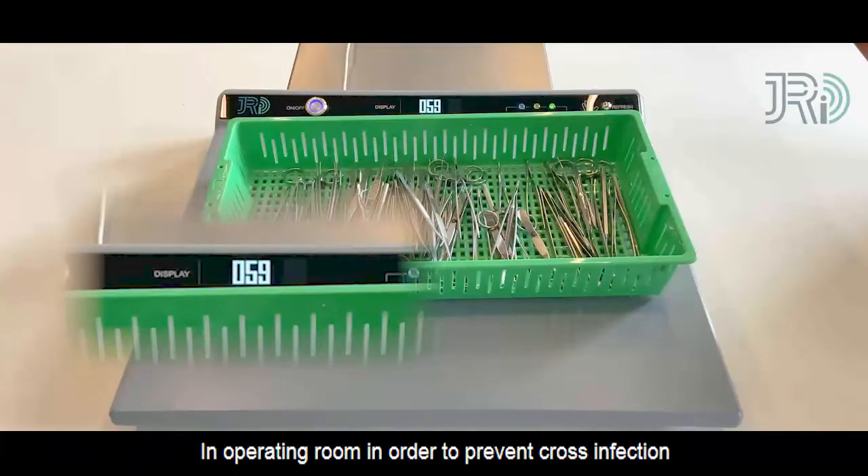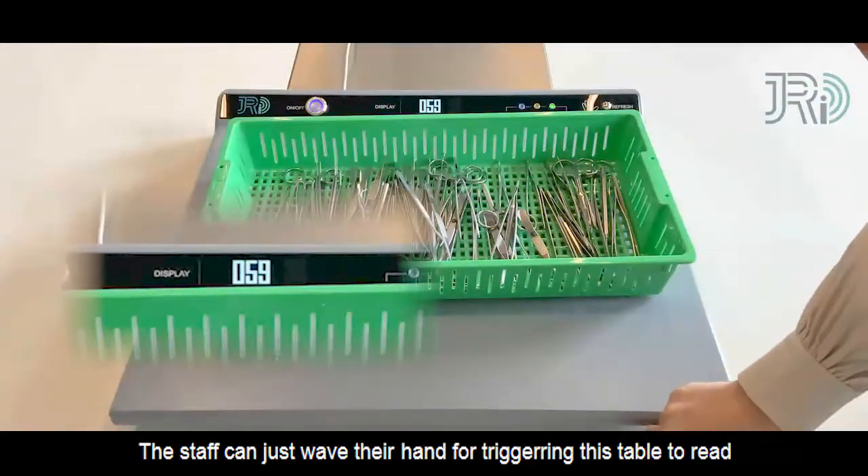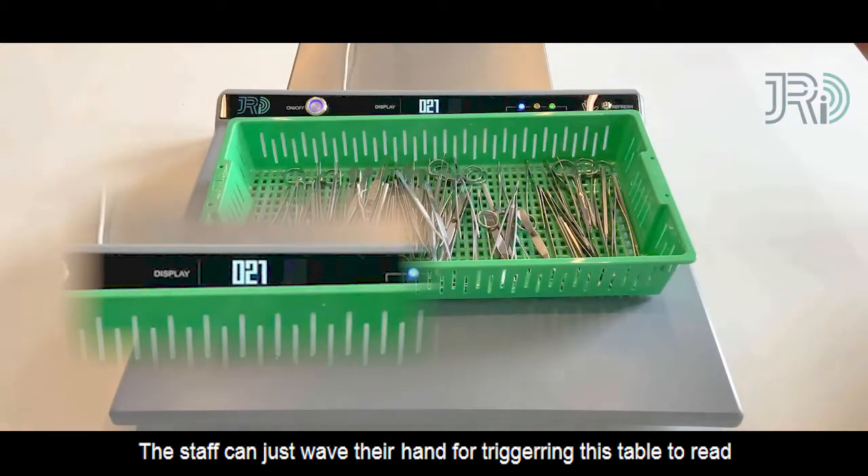In the operating room, in order to prevent cross-infection, the staff can just wave their hand to trigger this table to read.